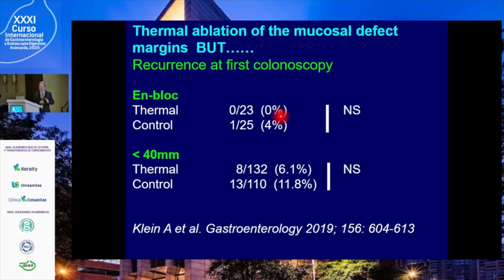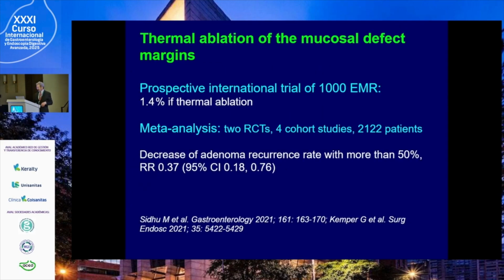So that means that, okay, this is the rule, but when you have a small lesion, when you perfectly see the margin, maybe it is not necessary. But we continue to recommend ablation of the margin. Okay, this should be the rule.